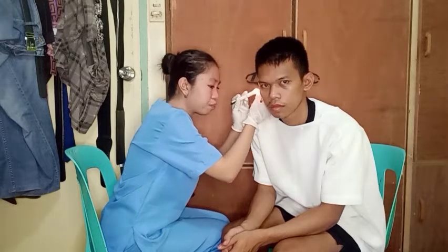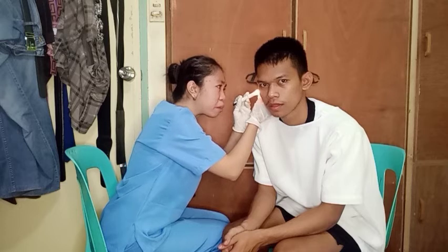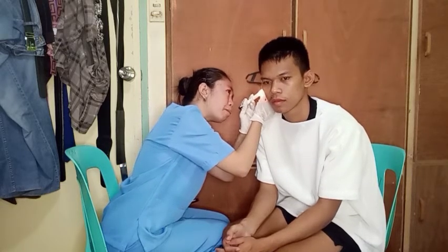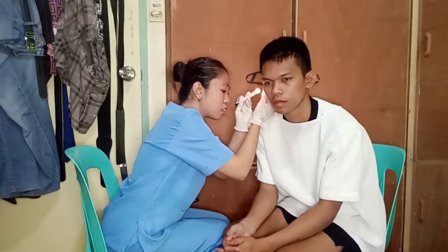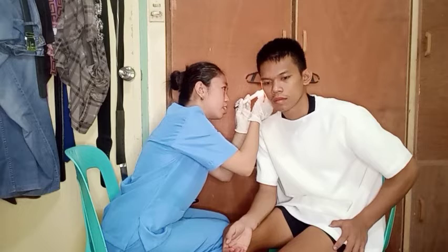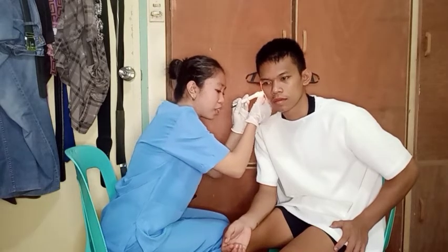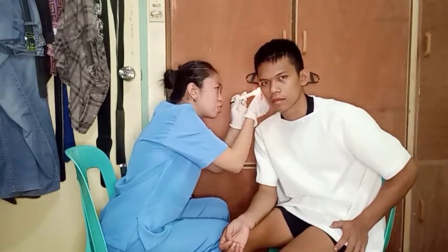Okay, thank you, sir. As I can see, the tympanic membrane color ranges from pinkish to pinkish gray, sir. There is no laceration on the pars tensa, and the pars flaccida is intact. The handle of the malleus as well as the short process are oblique in position and situated behind the upper part of the eardrum.